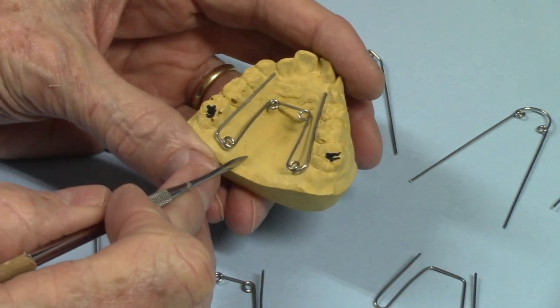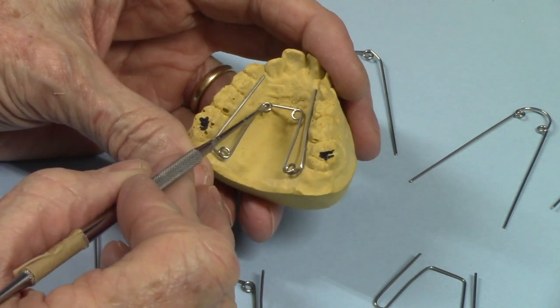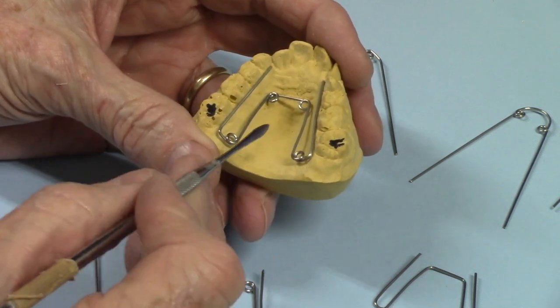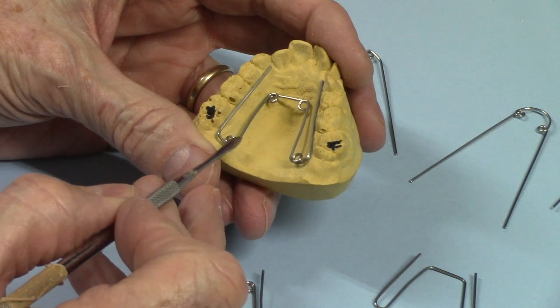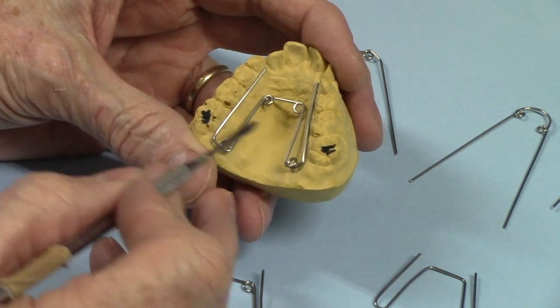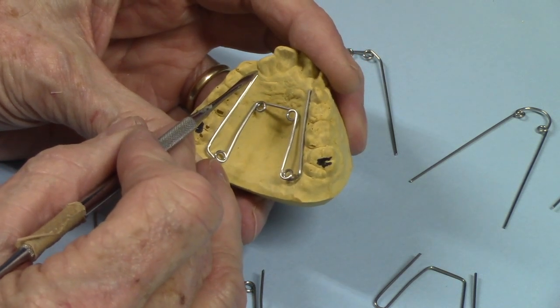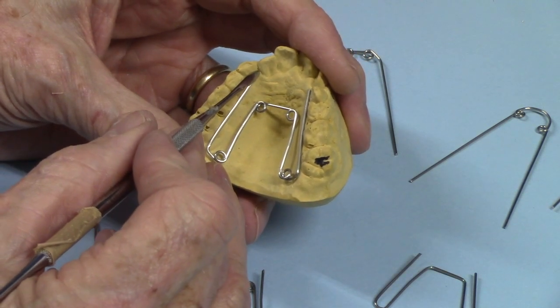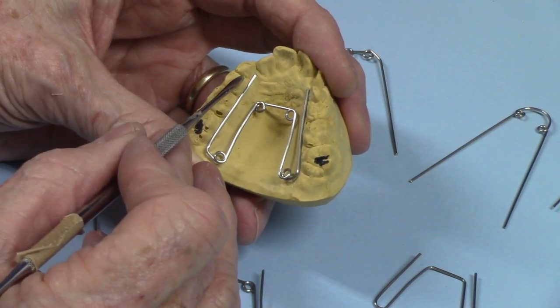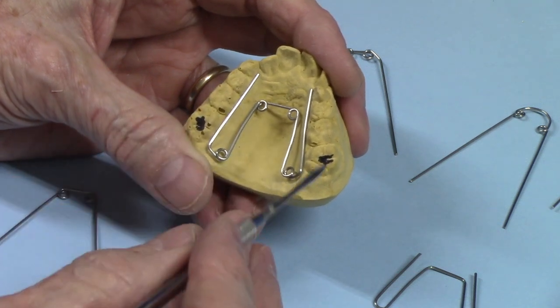Typically a quad helix appliance — this is one of many designs, we're going to look at several of them here — will have the four helices (that's the plural word for helix, or helixes). Hence the name quad helix, and then it will be soldered to the lingual of the bands. It will extend up typically and engage either all the way up to the middle of the mesial of the cuspid — in this case deciduous cuspids — or it can terminate at the mesial of the first bicuspid, or in this case the deciduous first molars.